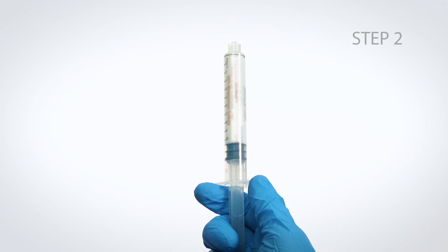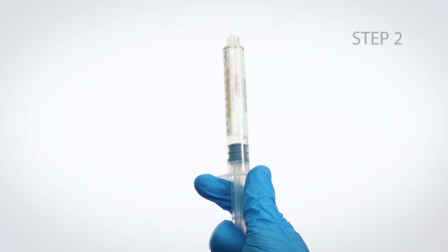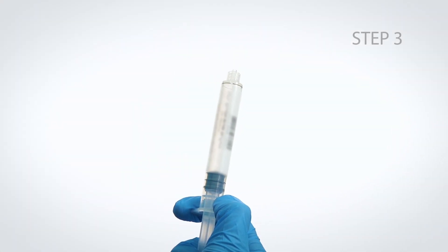Step 2: Hold the plunger and push the barrel forward to relieve any resistance that may be present. Step 3: Pull the barrel down until air is expelled from the syringe.